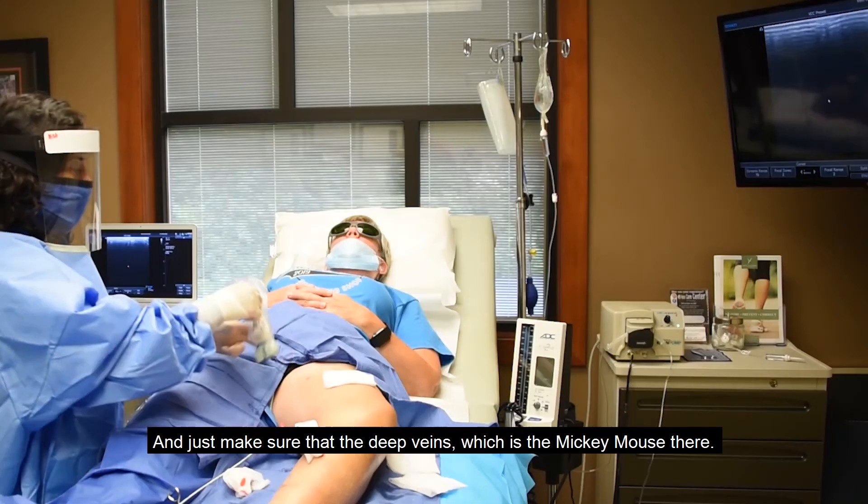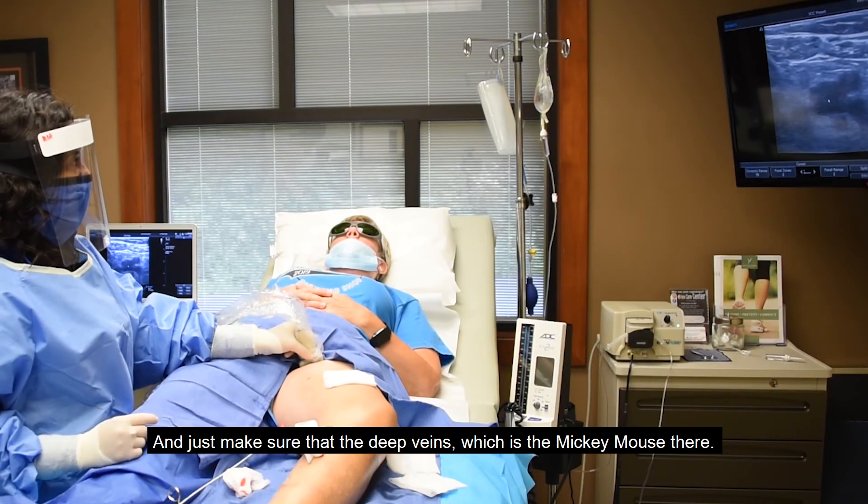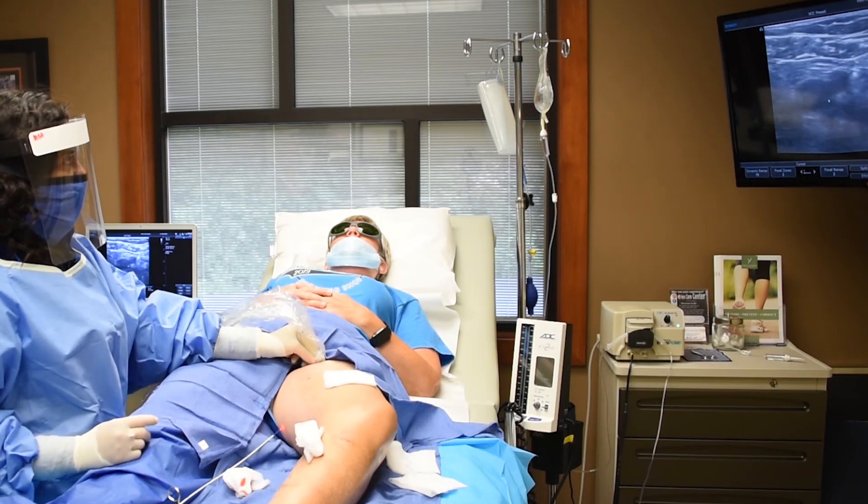We just make sure that the deep vein — which is the 'Mickey Mouse' shape there — we just make sure his face squishes, which it does. That's good.